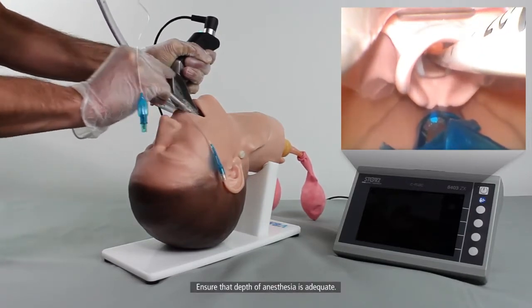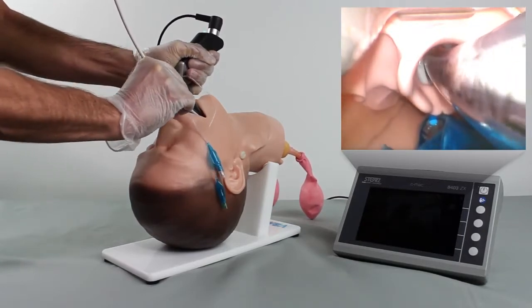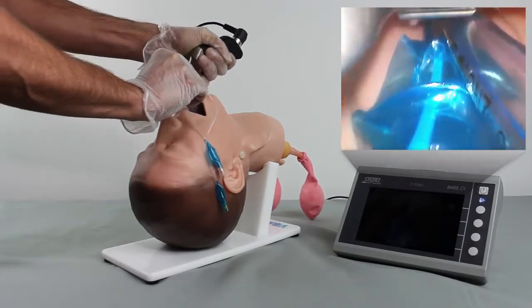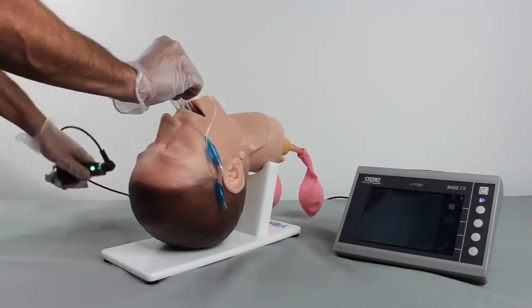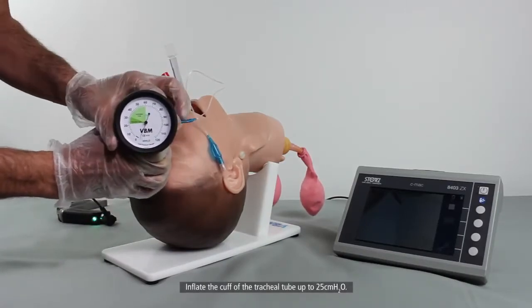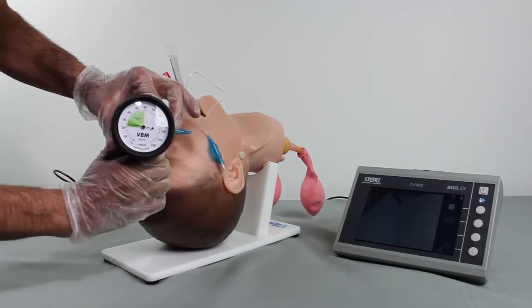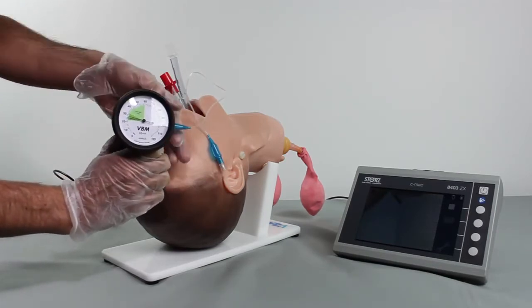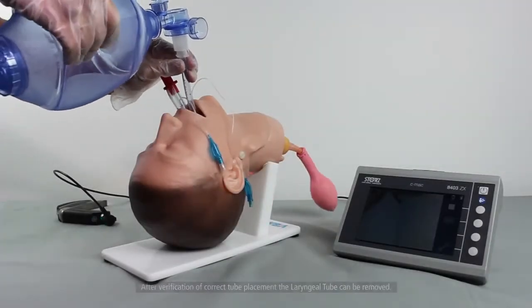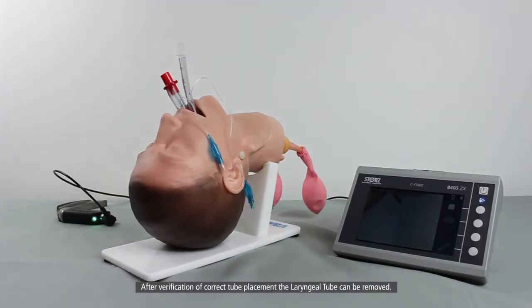Ensure that depth of anesthesia is adequate. Remove the bougie before removing the video laryngoscope. Inflate the cuff of the tracheal tube up to 25 cm H2O. After verification of correct tube placement, the laryngeal tube can be removed.